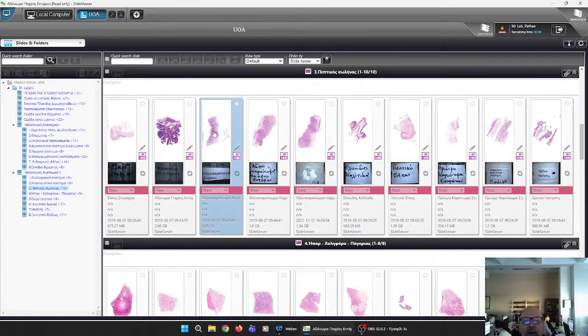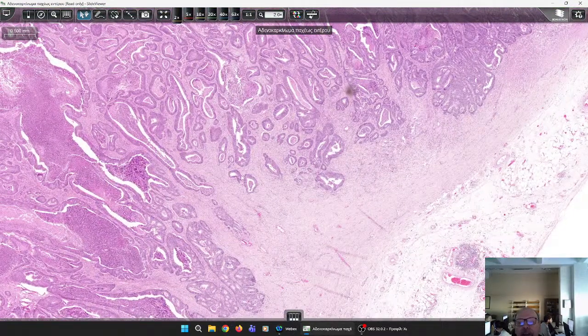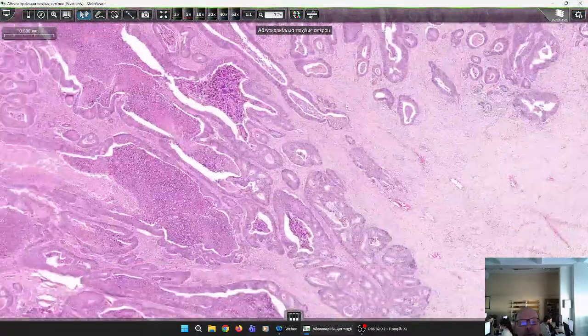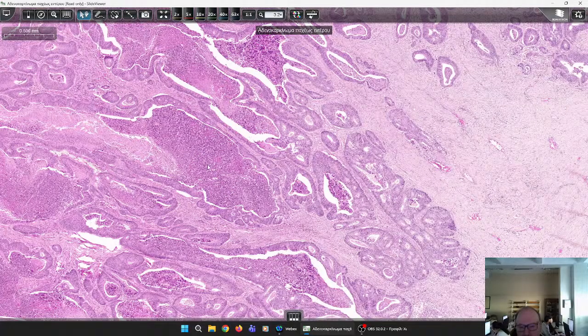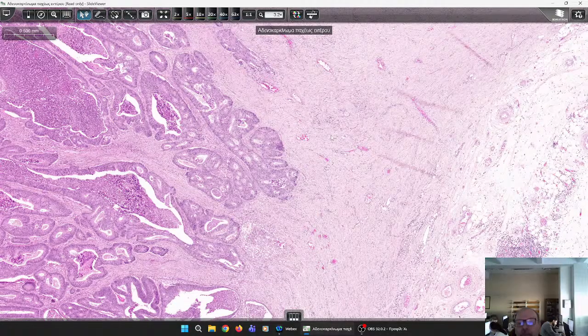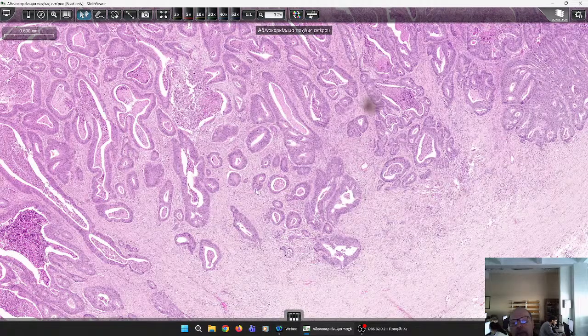Have a look at cancer now. Look here. We have tubular structures clearly invading the submucosa. In their lumen, necrotic material is often found. We have cribriform formations, indicative of moderate differentiation, and tubular cancerous formation, well distinct one from the other, consistent with high differentiation. With one word, we call this low-grade colorectal cancer, not high-grade.